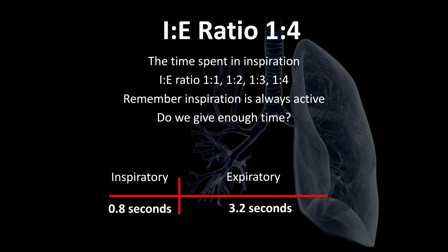Do you have enough time to generate enough pressure that's going to give enough volume based on the airway caliber? Or they're using the Revel and they're choosing to use a pressure breath. Same thing. Would a volume breath change anything? Ultimately, you have to have enough time to deliver enough breath based on the airway caliber.